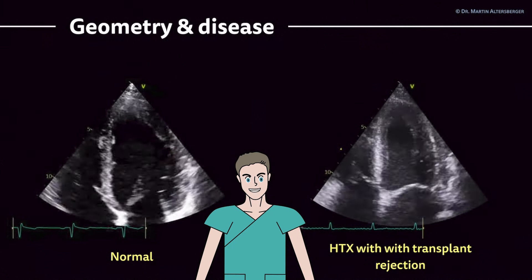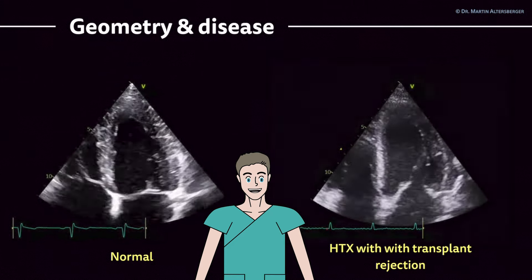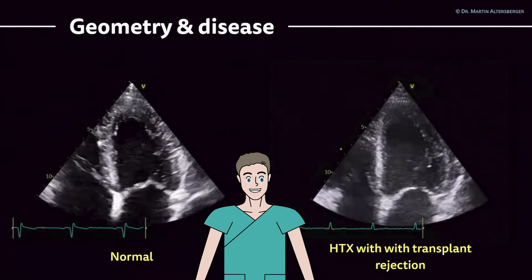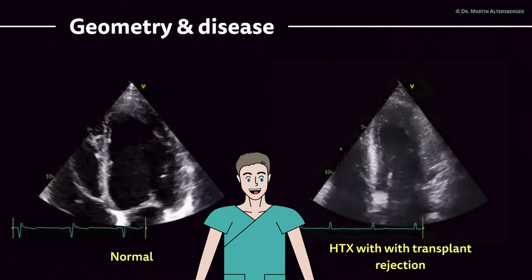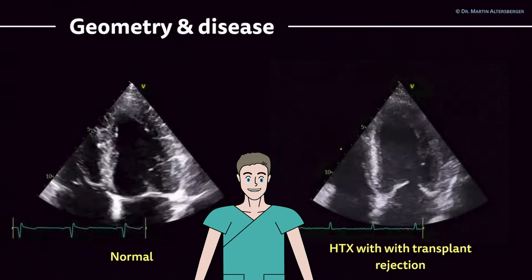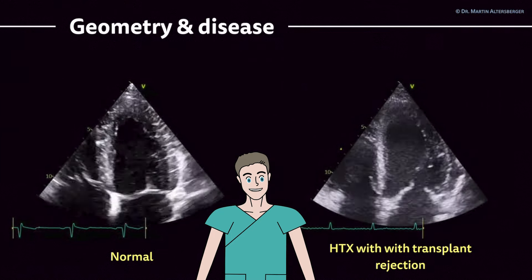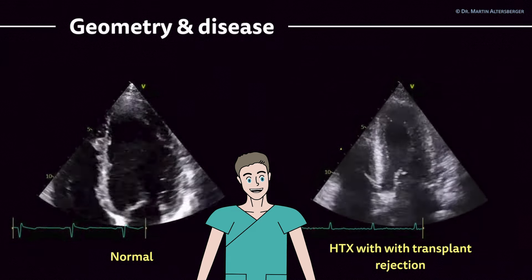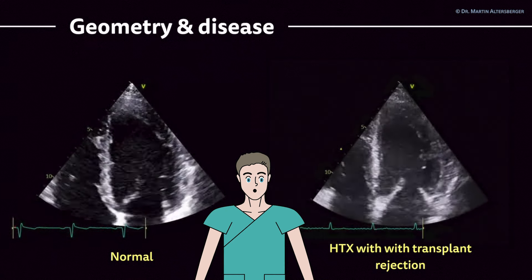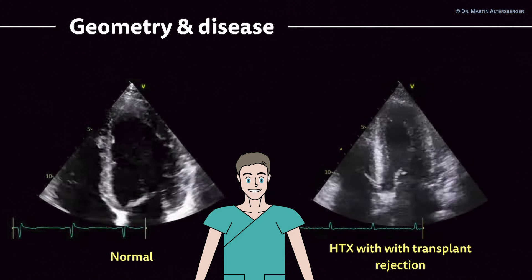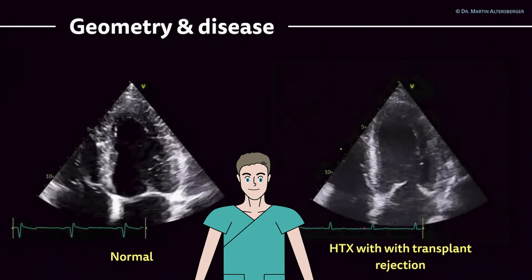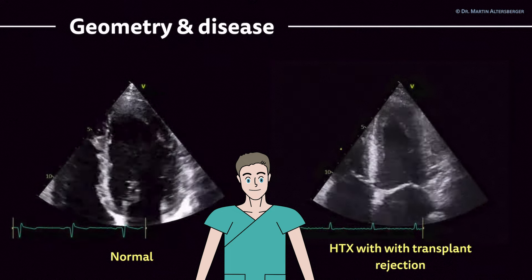Another example is a heart transplanted patient. The ejection fraction here is way better than in the previous example — around 60 percent. However, the myocardium is thickened. In a heart transplant patient, a thickened myocardium always raises the concern of transplant rejection, which was actually occurring in this case. Strain imaging was markedly reduced. Comparing with a normal transplanted heart, the walls should not be thickened.